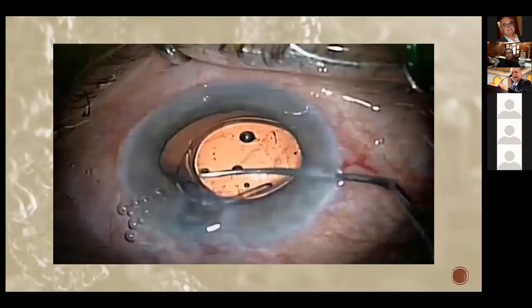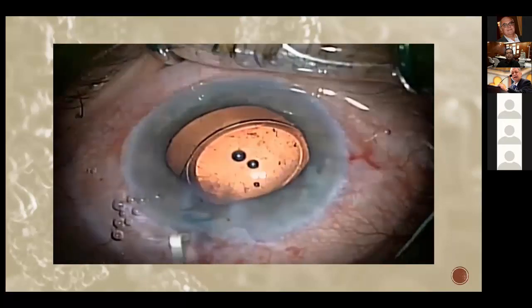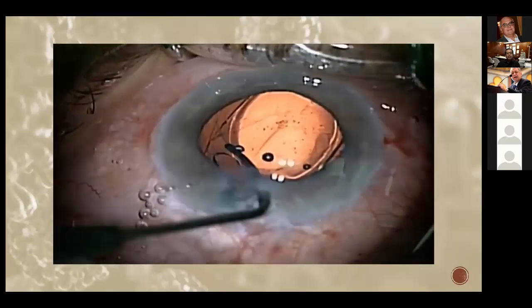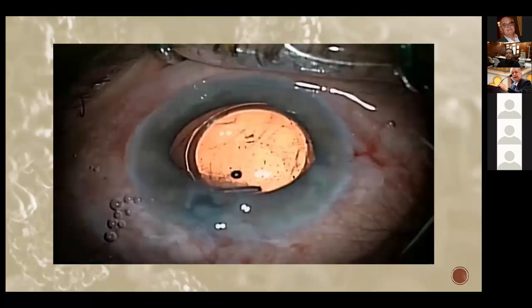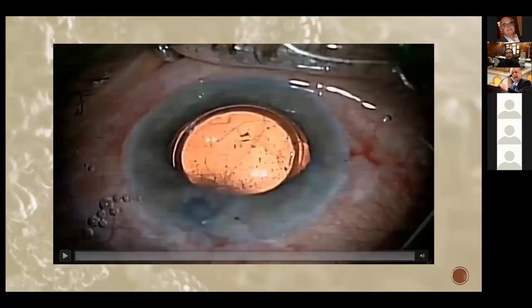And you see the lens inside the bag. I'm going to use the main tunnel to manipulate it. So that's it. The trailing haptic is going in easily and softly, and this is the Rexes, and that's the case. Dr. Yehia, would you like to comment on this case?